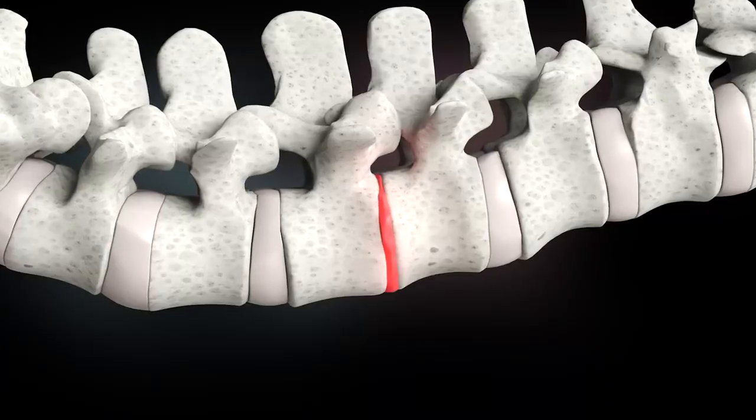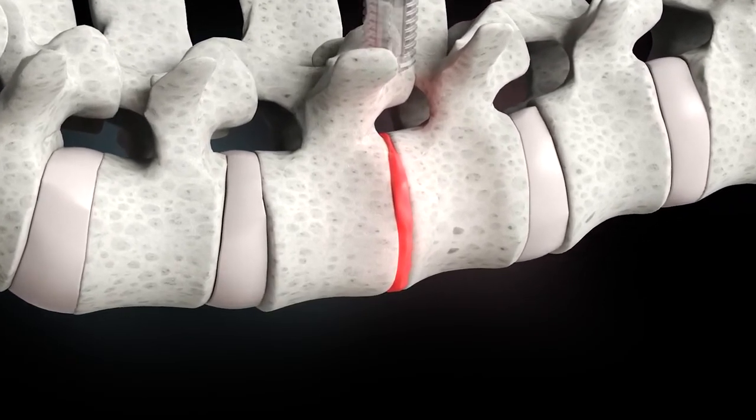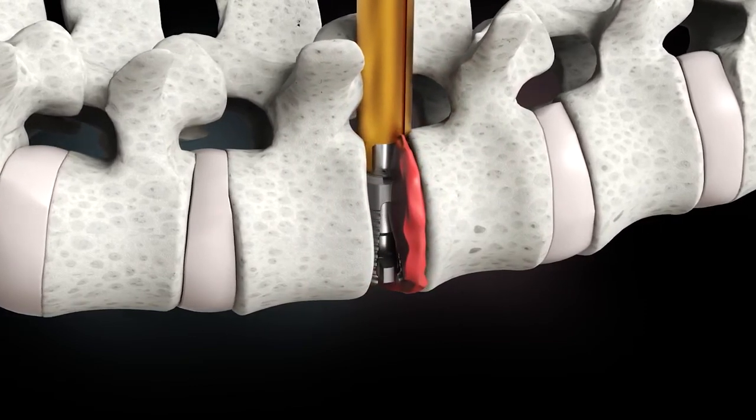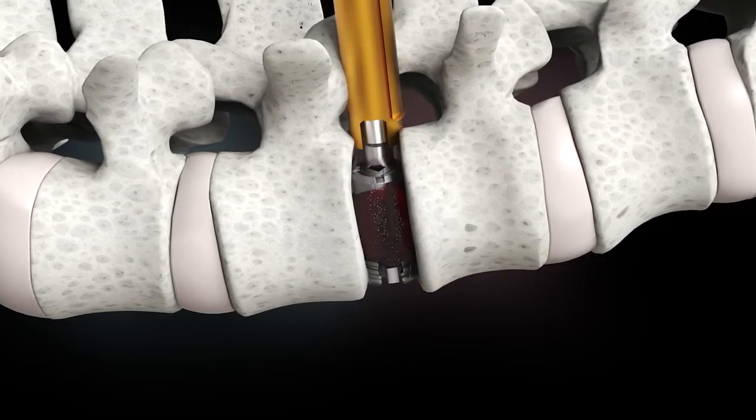By replacing the disc with the metal shim, I'm able to restore your height and alignment. By restoring your height, we restore the tension to the ligaments — the cables that hold you together. This immediately makes the joint more stable.